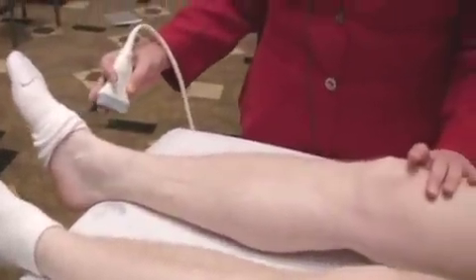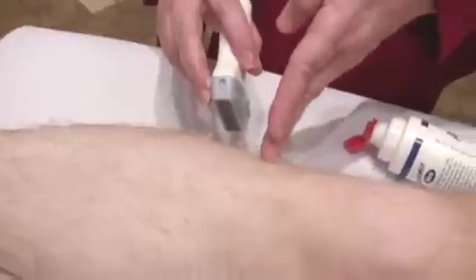And then just to wrap it up, we found the dorsalis pedis at the top of the foot and followed it back as it became the anterior tib and continued all the way up to about here, where it dove down away from us to come back up into the popliteal.